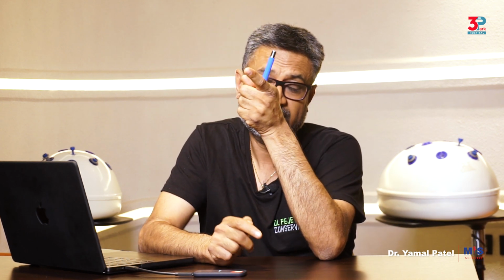What is gaze training? So gaze training means they've actually done studies where they put in VR and then the surgeon's view was put on the VR for the assistant. So the assistant was not seeing the screen directly, the assistant was seeing what the surgeon was seeing. And they actually realized that the learning curve was much faster when the assistant was shown what the surgeon was seeing, meaning where his gaze was going all the time, than when the mentee is seeing his own screen and they are seeing different locations. The surgeon's gaze is on a vessel, but the assistant is seeing something else. So if we make them see the same thing following gaze training, the learning curve shot up very quickly.